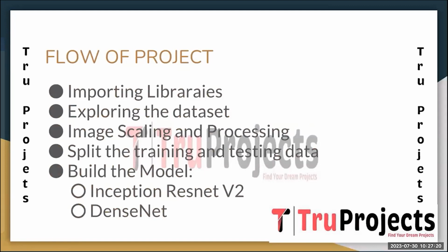The model's depth and structure allow it to capture intricate patterns effectively. However, due to its complexity, training Inception ResNet V2 may require significant computational resources and time. In this project, we evaluate its performance in detecting neovascularization and assess its potential advantage over other methods.